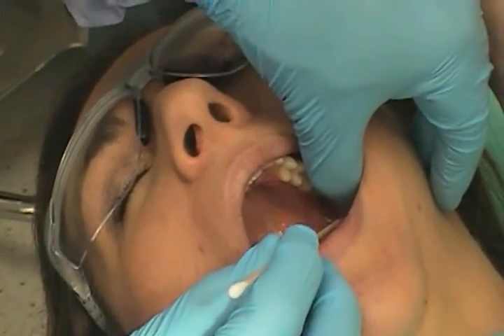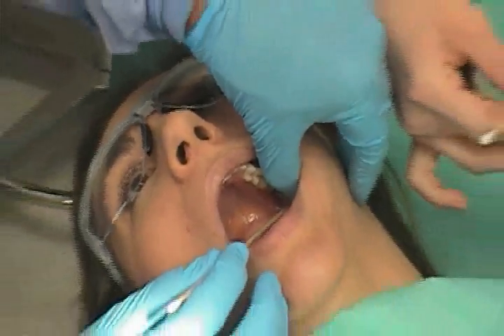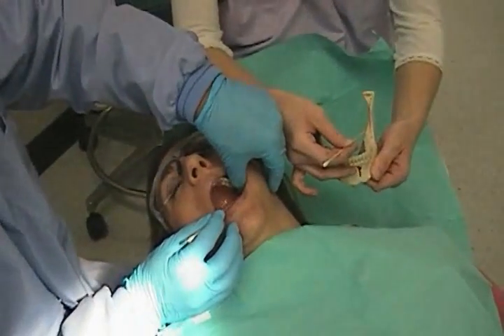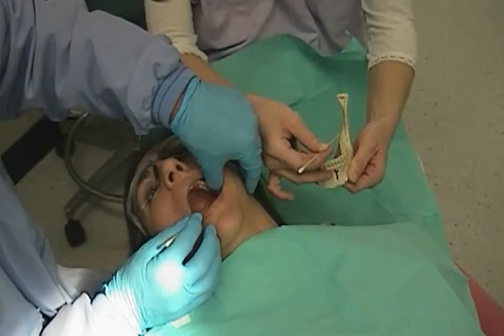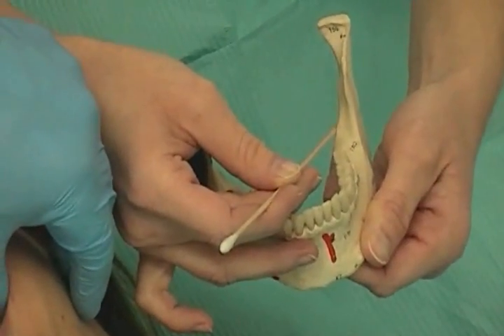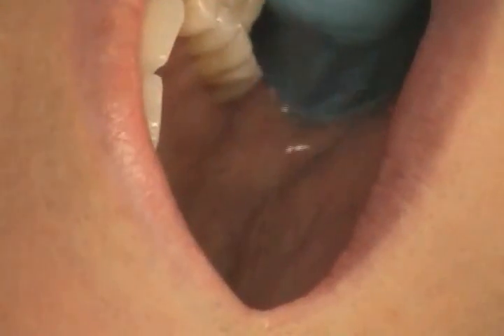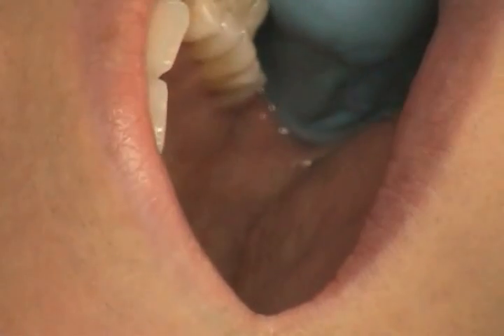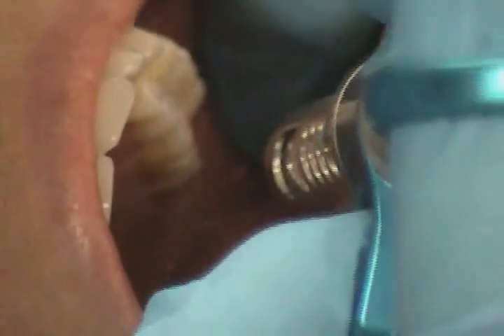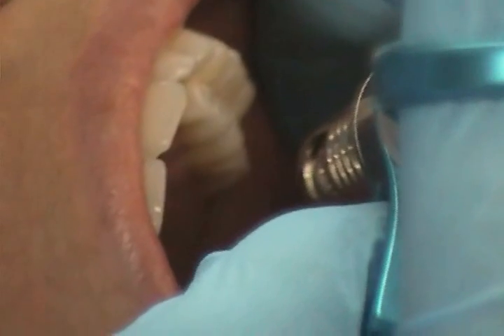At that point, you will swing over to the normal contralateral side and proceed to the final length, which leaves about four millimeters of a long needle showing. At that point, you would do everything exactly as you would with a normal inferior alveolar injection. To summarize: enter on the ipsilateral side, inject halfway, then swing around contralaterally and insert the rest of the way to the target area.